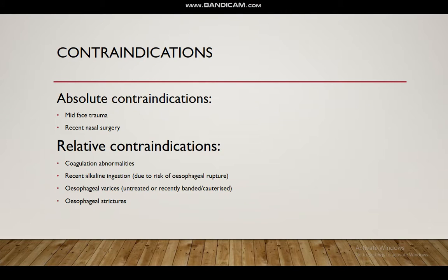Contraindications may be divided into two categories, absolute and relative. Absolute contraindications may be mid-facial trauma and recent nasal surgery. Relative contraindications may be coagulation abnormalities or recent alkaline ingestion, esophageal varices, and esophageal strictures.